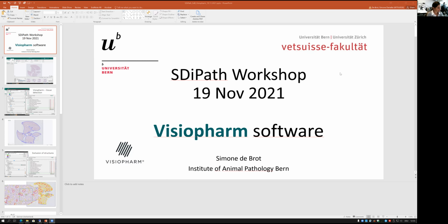Yes, I'm based here in Bern, and I actually ended up using Visiopharm software because I am a pathologist, a veterinary pathologist, and unfortunately with limited IT skills. So I looked for a tool that I can use to assess slides, ideally in an automated way, as well as having a deep learning classification available. And I have started using this software in spring this year.